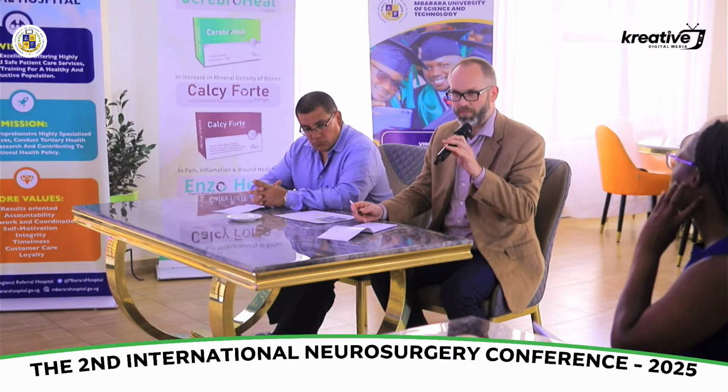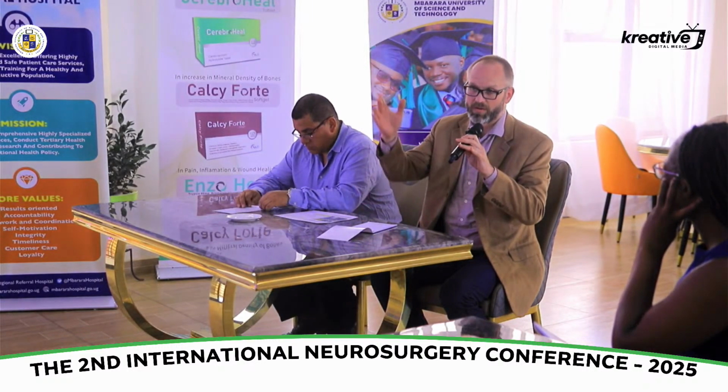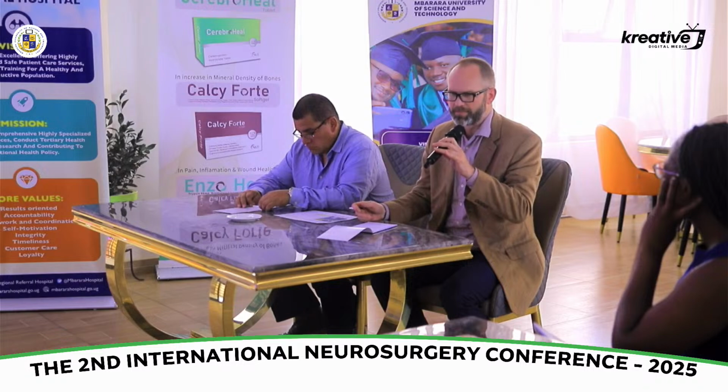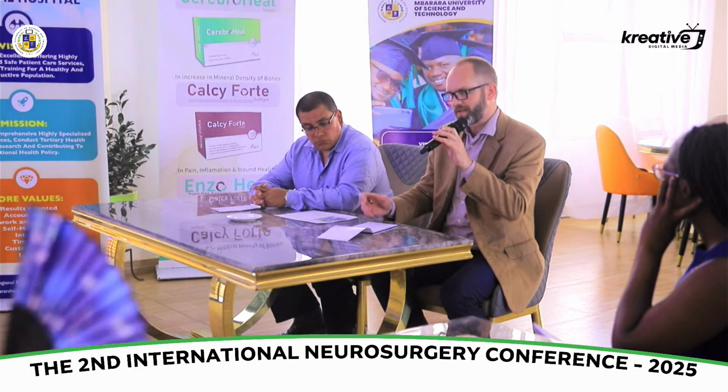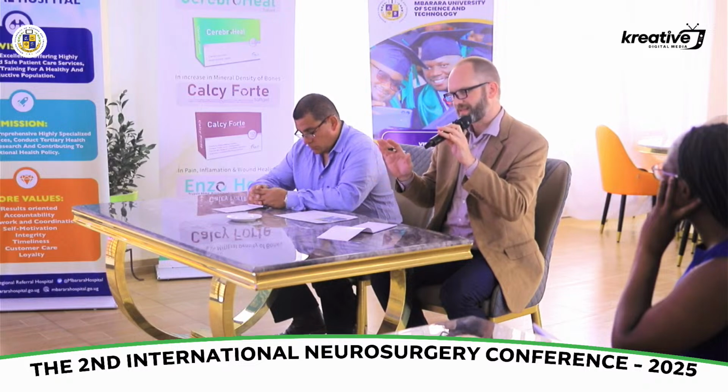So those are microbubbles that you inject intravenously. They cross the lungs and then go arterial. Can be very useful for glioma resections to help distinguish tumor from surrounding brain. But again, you have to have very special machines and probes to be able to use it. And for now, that's kind of on the far side of the learning curve.